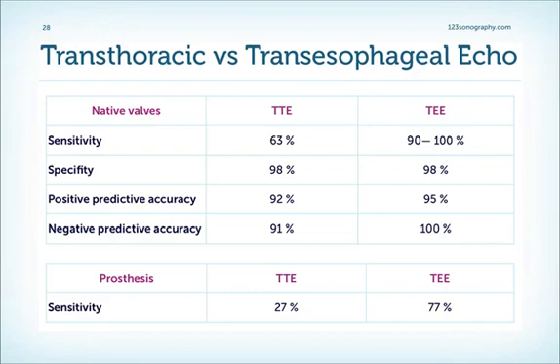And so, when would we perform transoesophageal echocardiography? Well, actually always. Both if we suspect endocarditis, but also if we already made the definite diagnosis with transthoracic echo. Simply because, with the help of TE, we can detect complications.